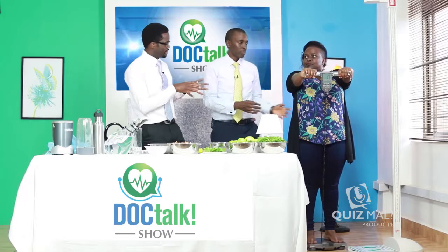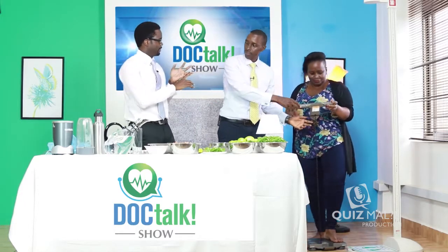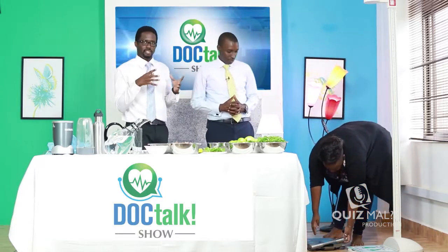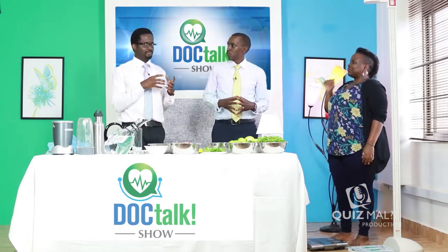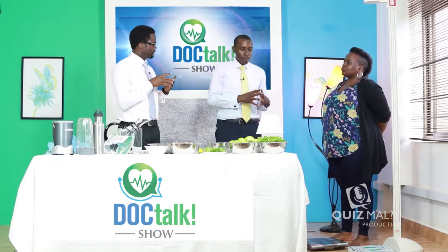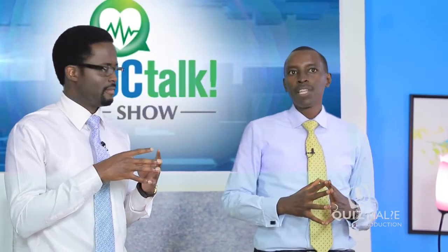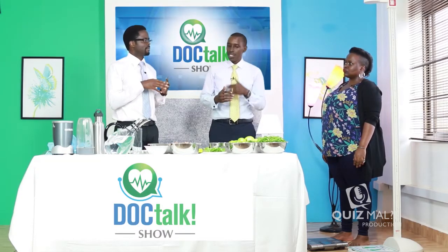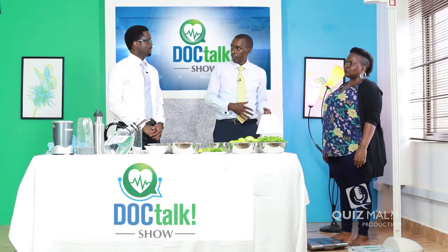So this machine is able to measure the BMI, it can measure the fat percentage and estimate the age. This age bit, what does it mean? So basically, we have the age, the number of years we've been alive, but the body age is really an assessment of your risk for health challenges. And if somebody's body age is 70, that means that challenges that you would get at 70, you could possibly get them at your current age. The good news is all these numbers get better very quickly.